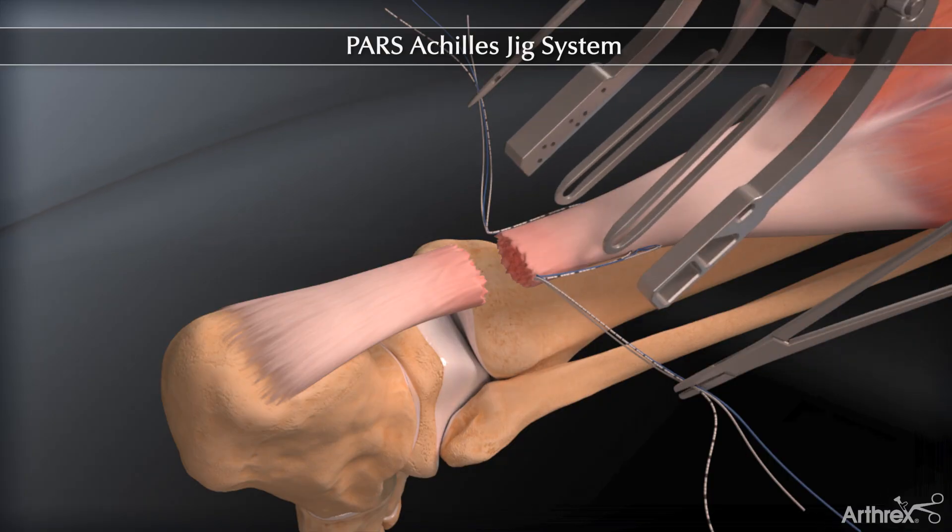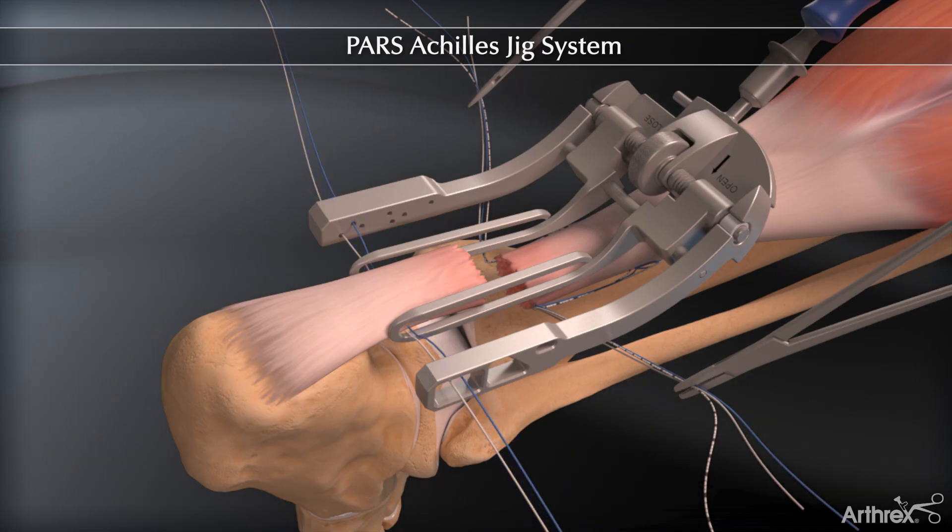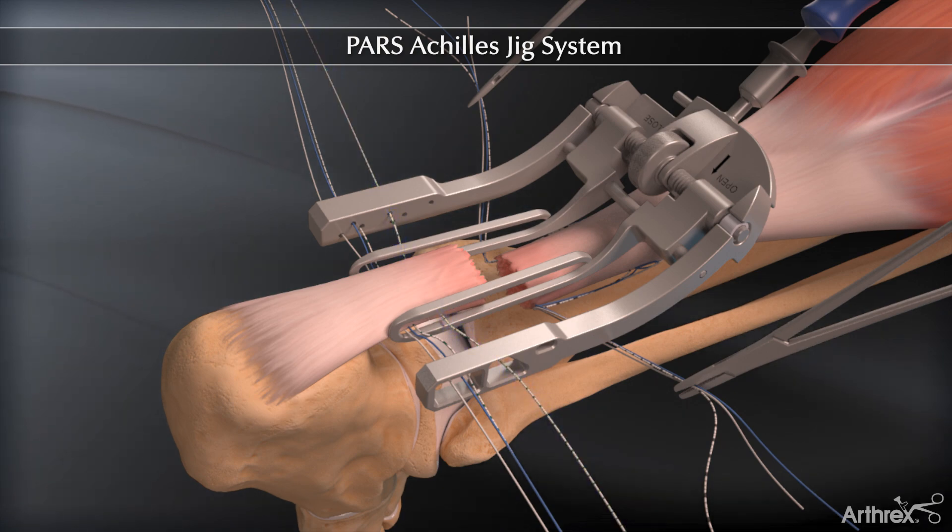Place the jig in the distal part of the incision and perform the exact same steps as for the proximal side of the tendon. The suture passing is repeated, creating a distal locking stitch.